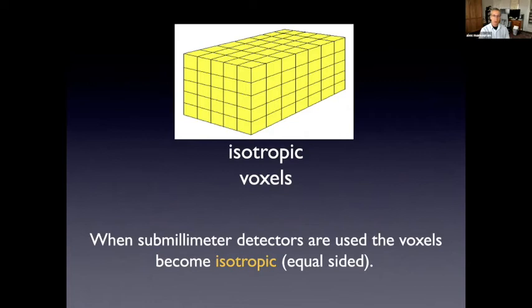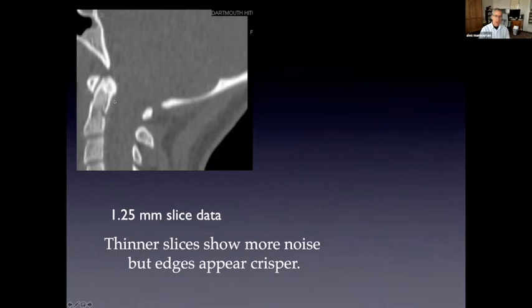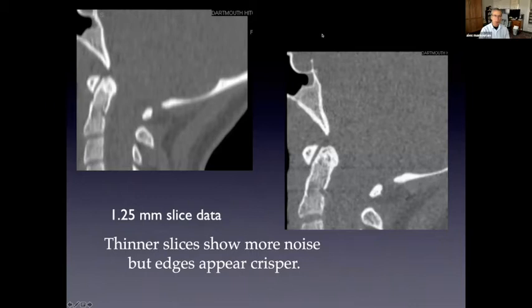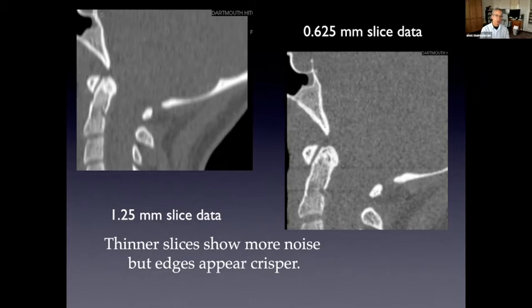And so this is a reconstruction. Here you can see a fracture through the dens. This is performed at 1.25. This is a 0.625 slice. Now we can see that this probably is not a fracture. This is probably a normal lucency you see about the growth center at the base of the dens. So the noise is higher. You can see this mottled look to the image. So we have a little more noise, but we have crisper edges because there's less volume averaging. And the voxel size is smaller, basically close to cubic size once we get down to a millimeter or less.